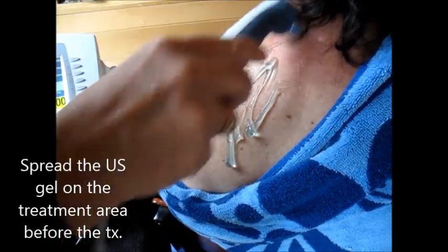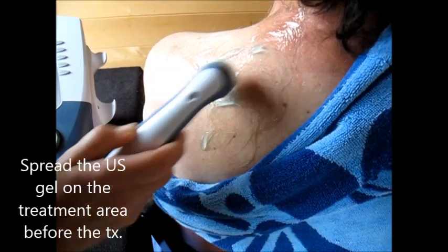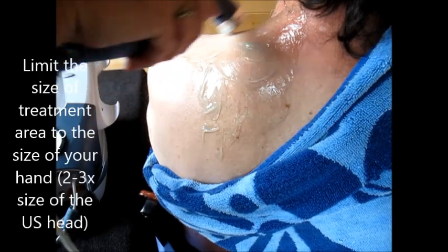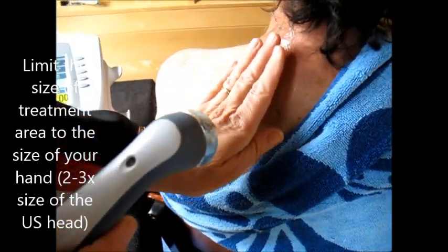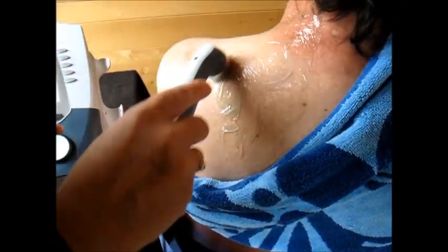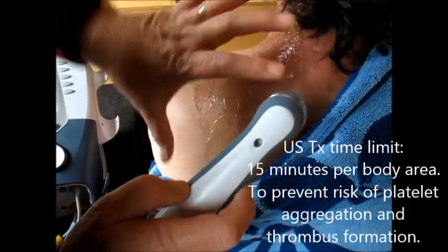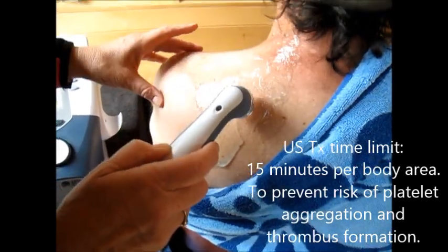The most important thing is to pre-spread your ultrasound gel everywhere you want to treat. Don't make too big of a treatment area because you're only supposed to treat about the size of your hand — so this will be one treatment and this will have to be a second treatment. There's also a limit on how long we're allowed to do ultrasound in one body area: no more than 15 minutes. A lot of times people will do seven minutes on one shoulder, seven minutes on the other.